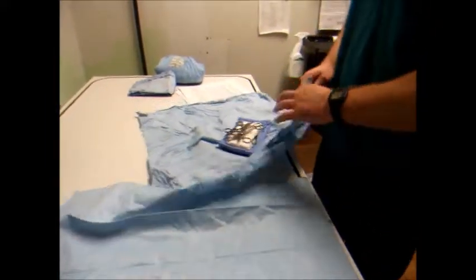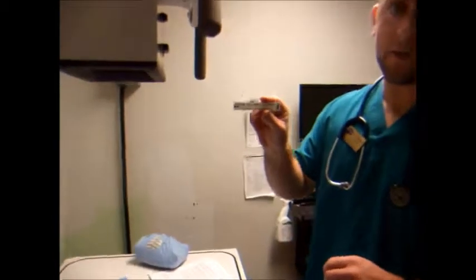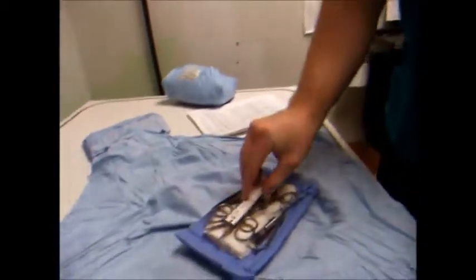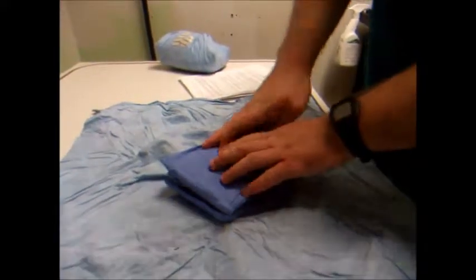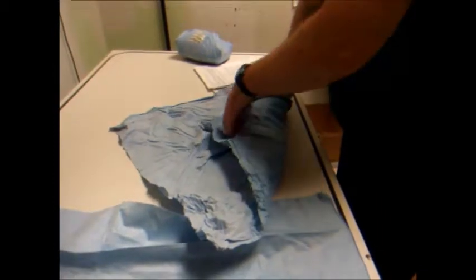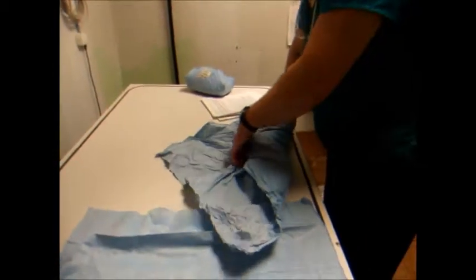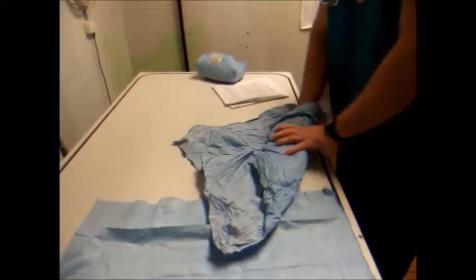We're going to wrap it. I've got my little strip to indicate that the pack is sterile on the inside. That goes right on top. We'll put our other drape and our other towel. And we're going to wrap it as tight as we can. That way first.